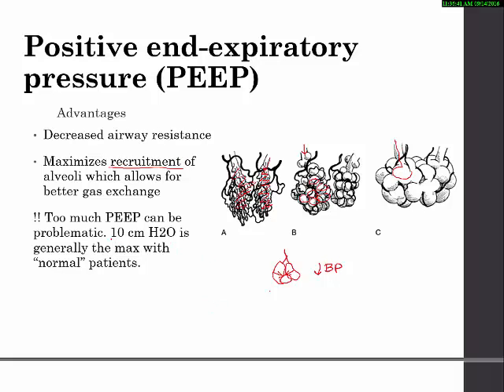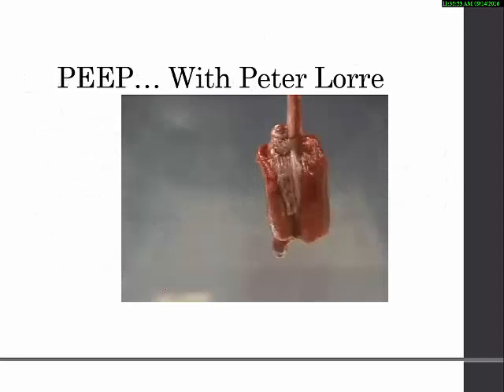In general, as with our protocols, we're starting patients at 10 centimeters of water, and that's what we're going to see for most normal patients. There may be changes based on that, and again, that's something that we're not going to determine, but it'll be determined prior to us getting a patient on the ventilator.